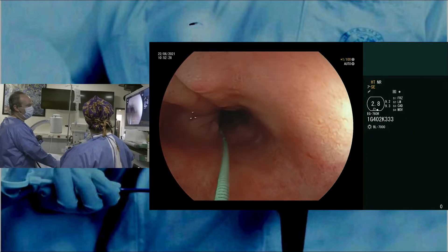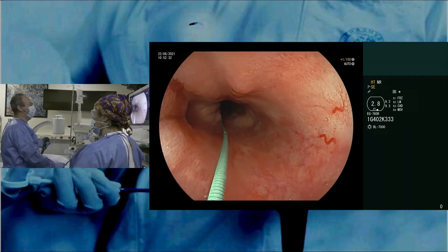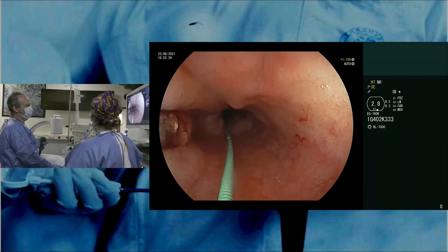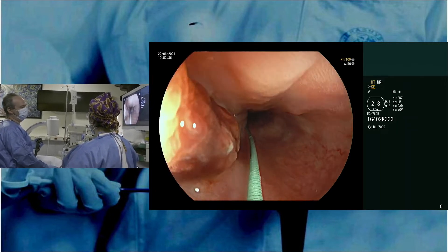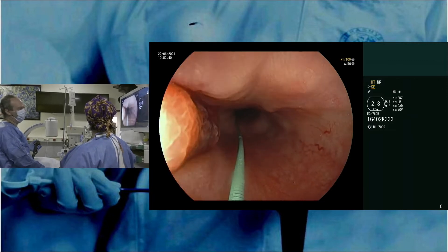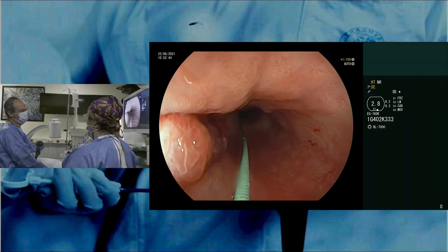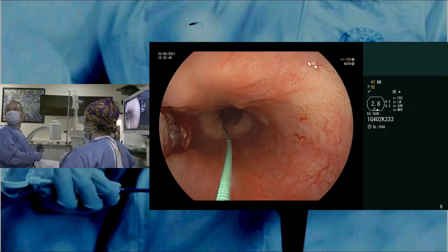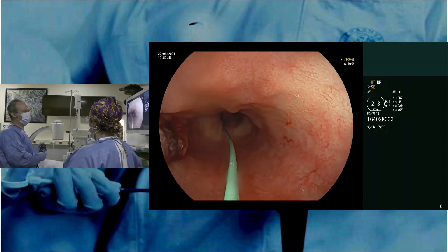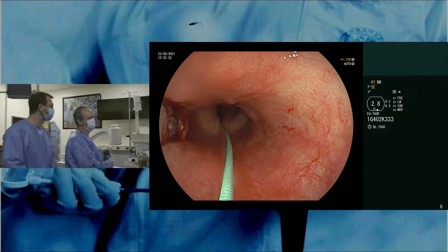Obviously you need to double-check that there are no visible lesions, and we had a little bit of a surprise when we came here. Pierre, where you can see — or you would say, 'oh, this is wrong, there's a visible lesion' — but actually there was a hemoclip here after the EMR that we tried to remove. I think the patient bled after the EMR and was rescheduled for emergent endoscopy and they had to put a clip, and this is probably that clip still in place.